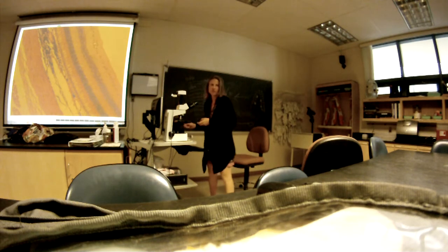Okay, so then you have the light coming in this way. It's got to go past these other cells, and it's a little counterintuitive, but the rods and cones are the ones that are stimulated by the light, and then they relay the messages back this way. Ganglion cells carry it all the way back to the optic disc. Does that make sense? Yeah? That makes sense?